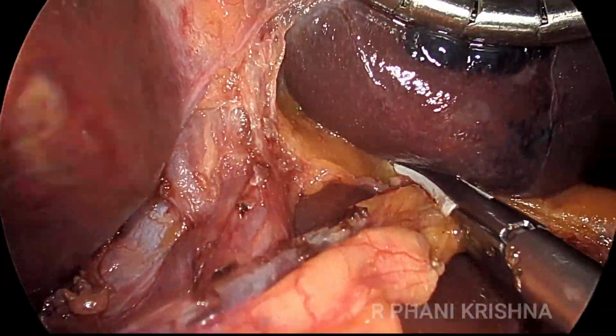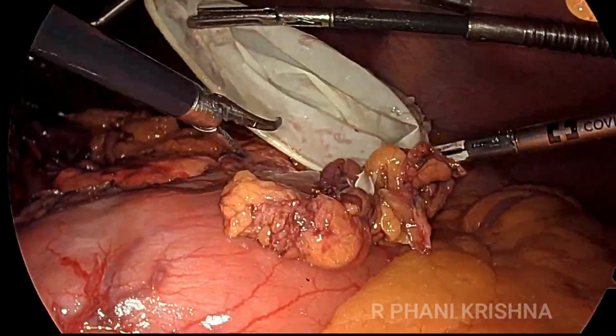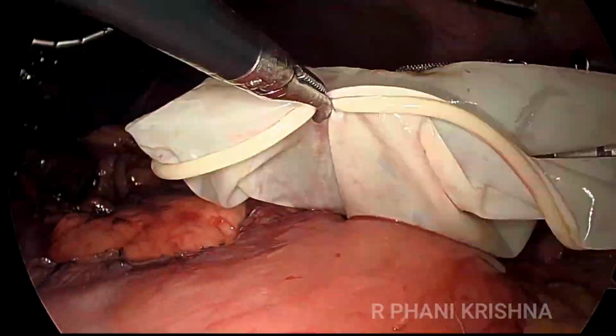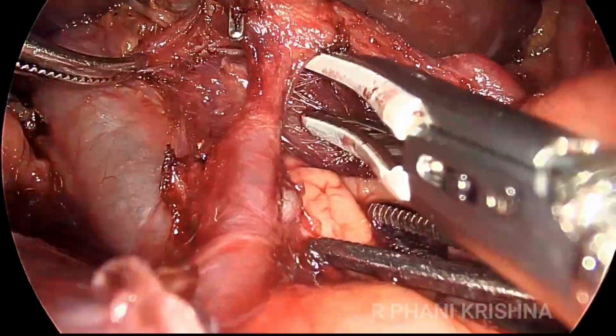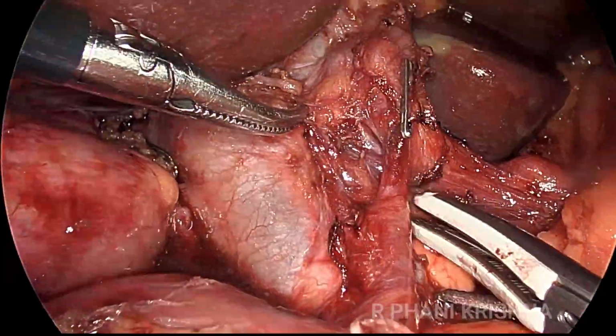The last part of the gastrohepatic omentum is being detached. All this lymph nodal specimen is placed in a specimen bag.